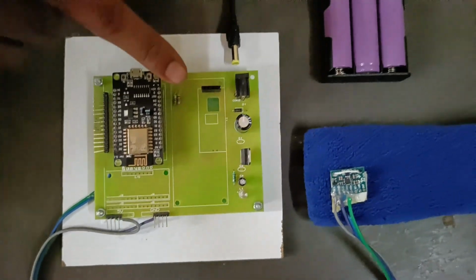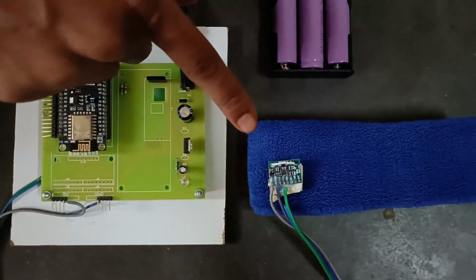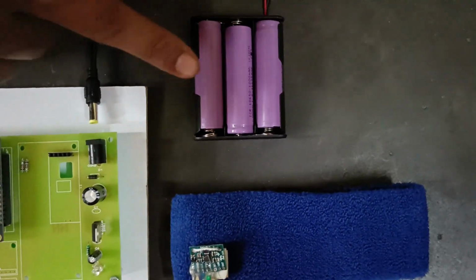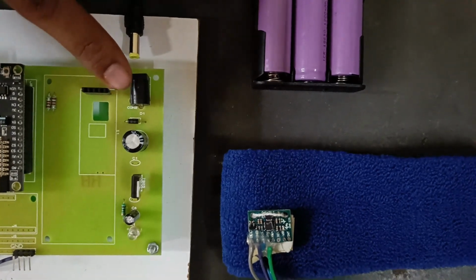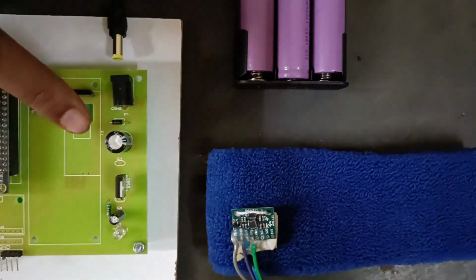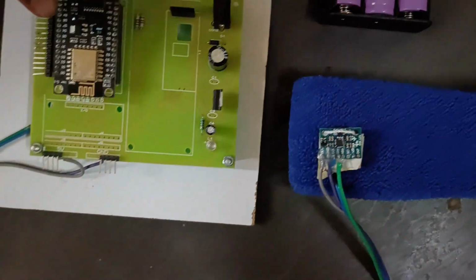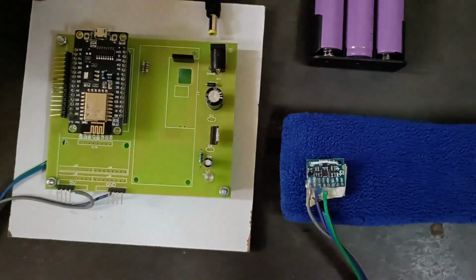The PCB board, the microcontroller and the accelerometer get power supply through a 12 volt lithium ion battery, which is connected to the PCB board with a step down voltage regulator. The step down voltage regulator steps the 12 volts down to 5 volts. The 5 volts is supplied to the Node MCU and also to the accelerometer.